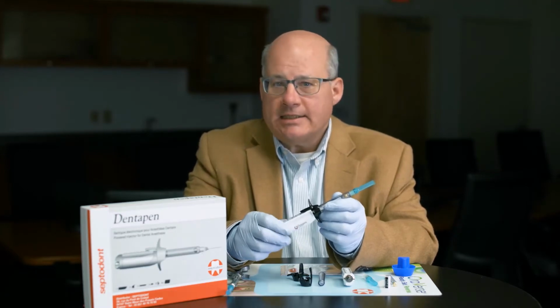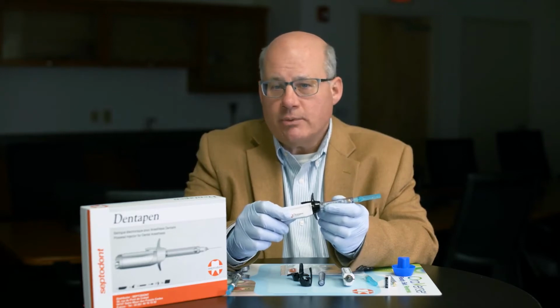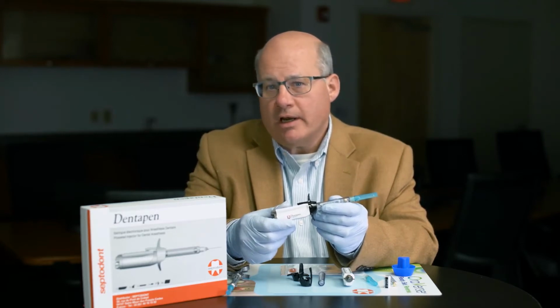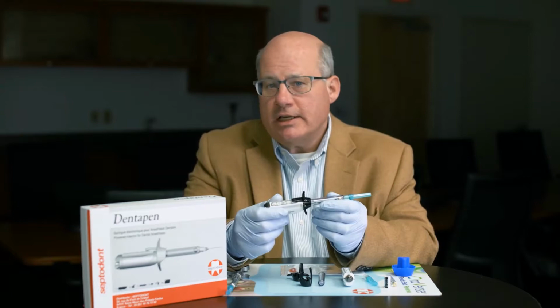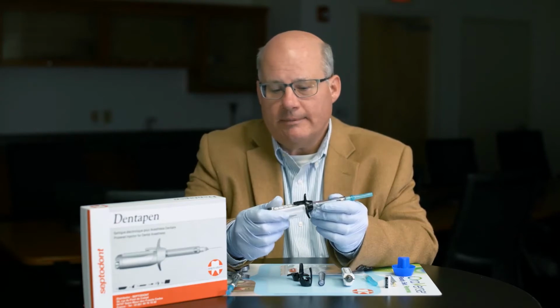So anesthetic is acidic. When you inject a full cartridge in 20 seconds, it's like pouring lemon on a cut. It hurts. By injecting slowly, it allows your body to adjust the pH of the anesthetic to be more neutral and take the sting away.